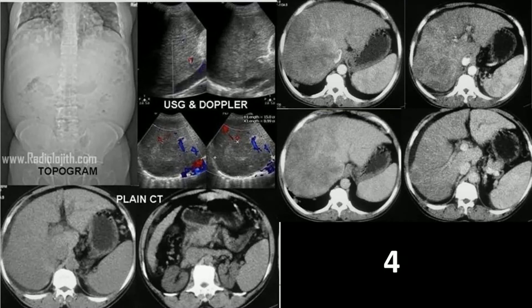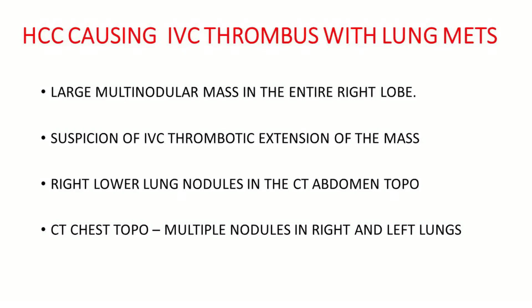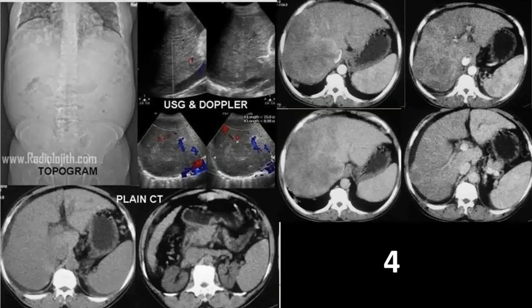Can I give you the answer? Ultrasound and CT of the liver show a heterogeneous multinodular mass in the entire right lobe of the liver, probably involving segment 4 of the left lobe, with high suspicion of IVC thrombotic extension of the mass. With this suspicion, it is better to evaluate the lungs, but unfortunately we have not given the chest images.